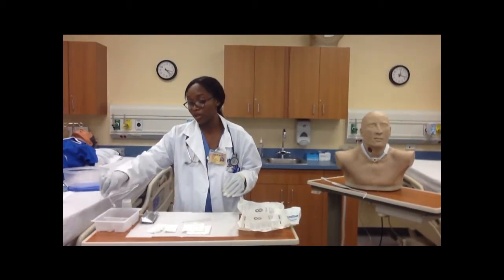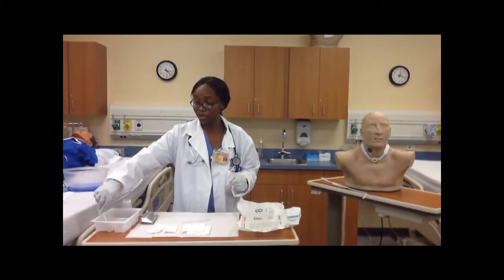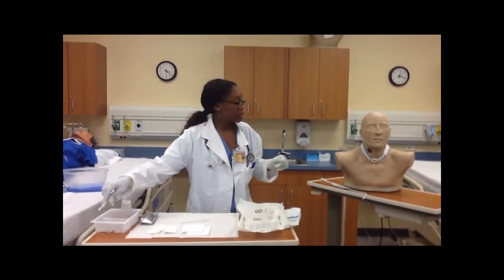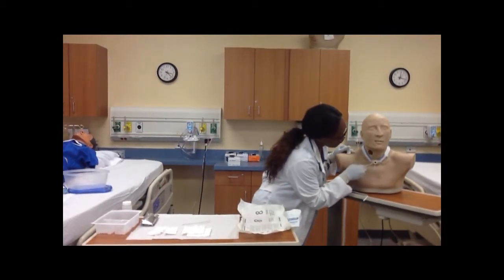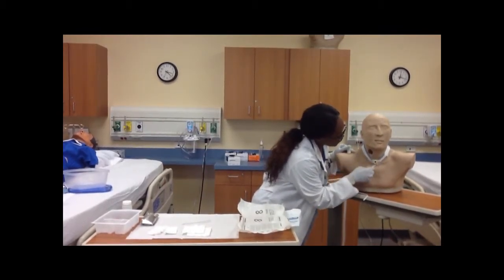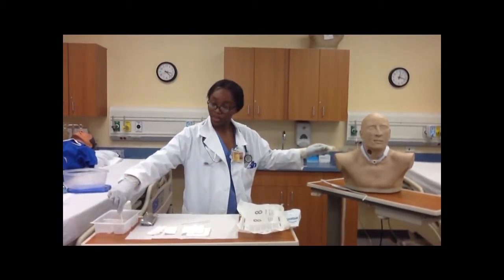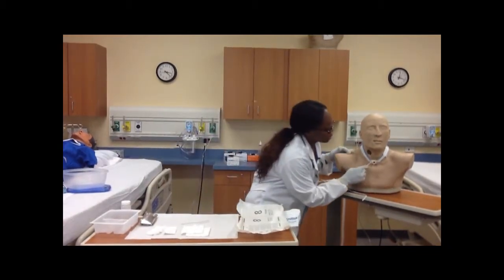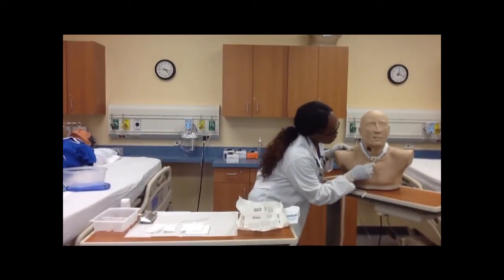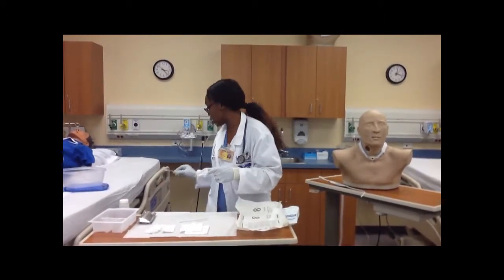I can follow with this cotton applicator. I'll dip it into the saline water, and I can clean around it. And I dip it one more time into the second compartment of the saline water, and I continue to clean around it with the water, rinsing off the peroxide so that the patient doesn't have any skin breakdown. And I discarded that as well.